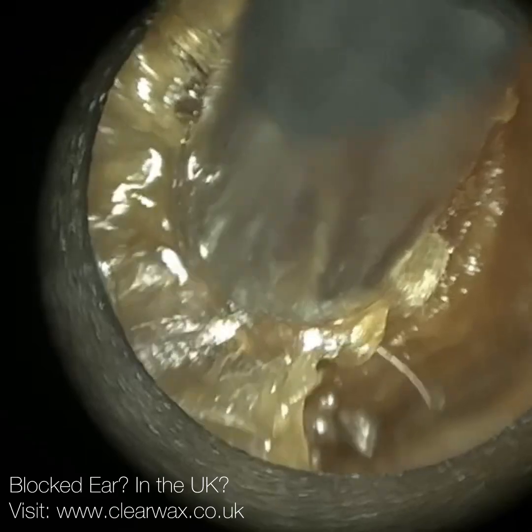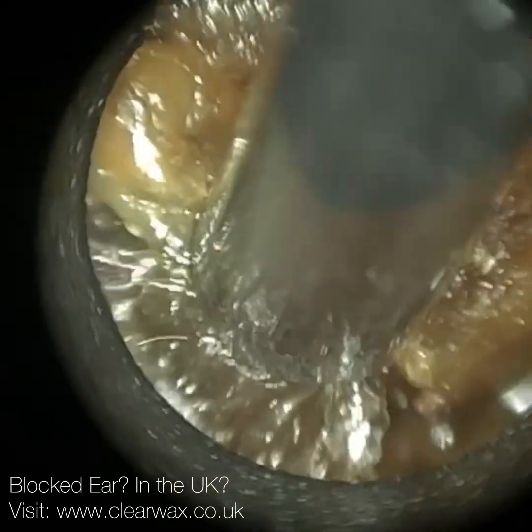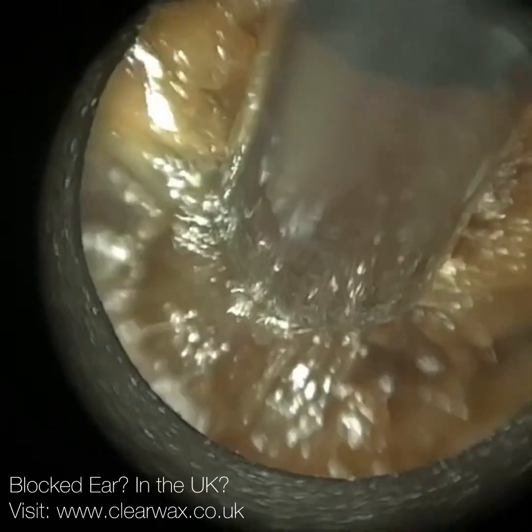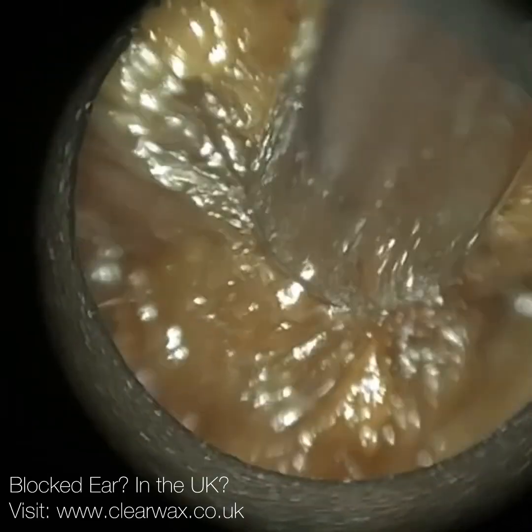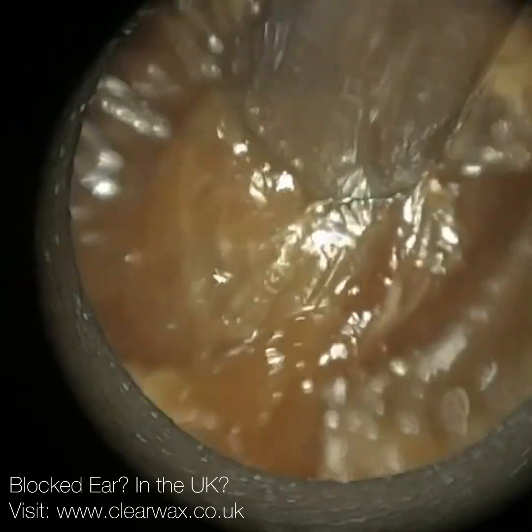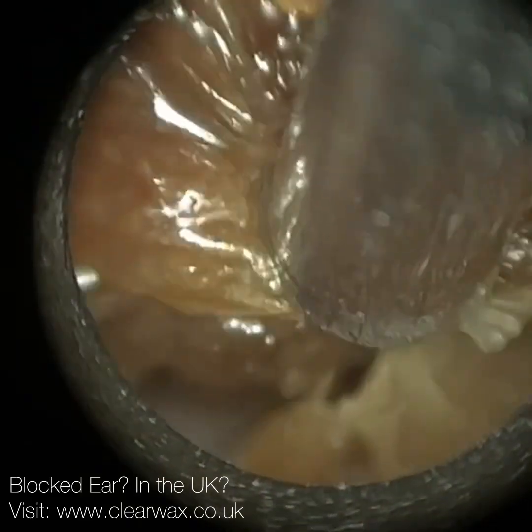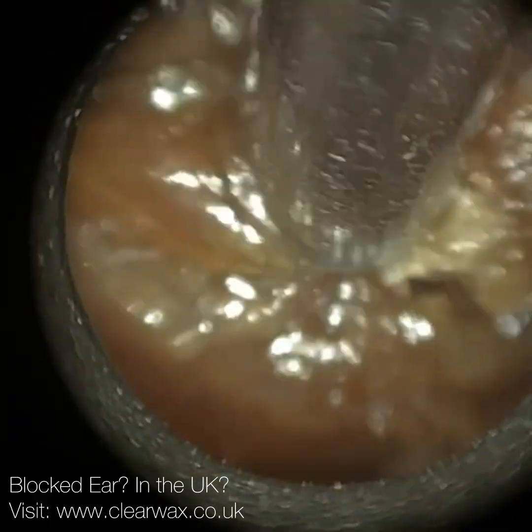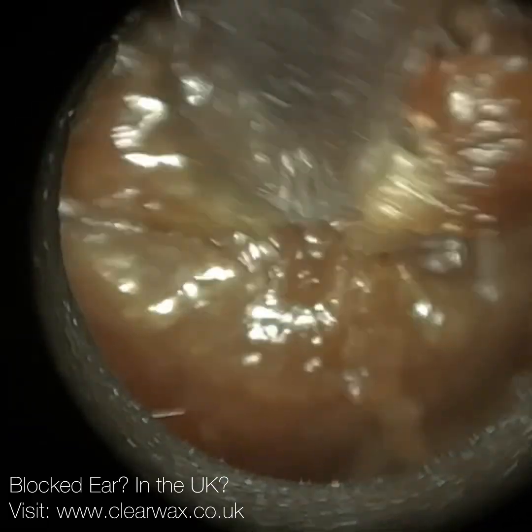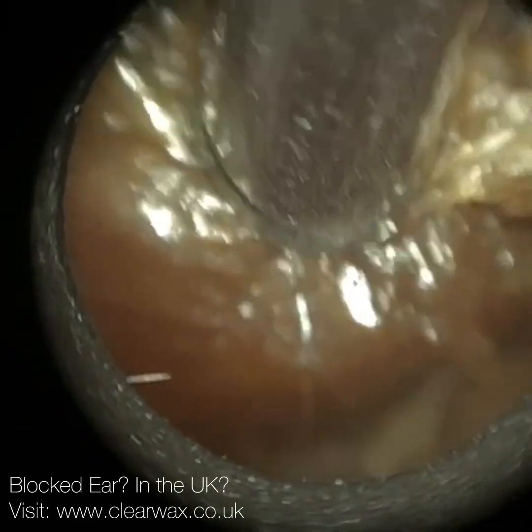A T-tube is a ventilation tube, and it's more of a long-term grommet. In the UK, your normal standard grommet - we call them shah grommets more specifically - they get different variations, but they are typically more short-lasting. They can be retained within the eardrum for between 6 to 12 months.